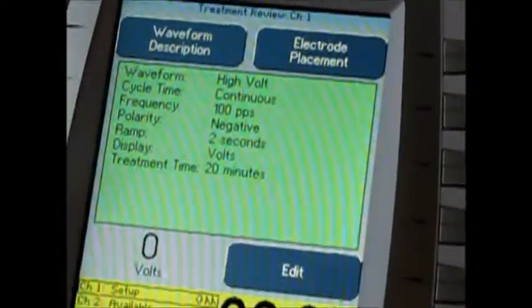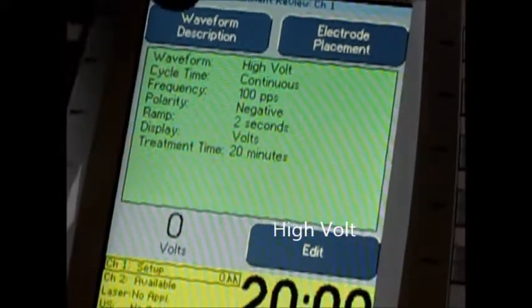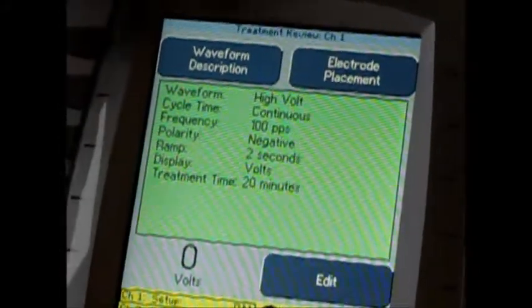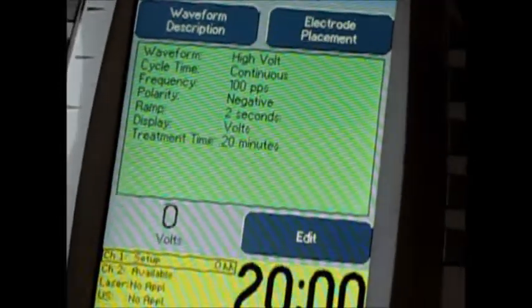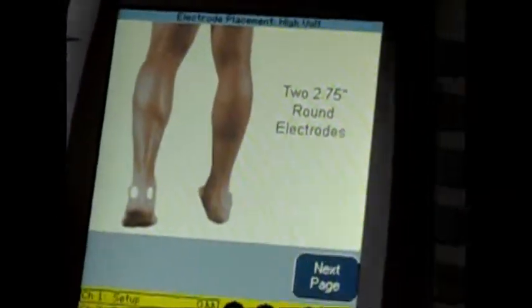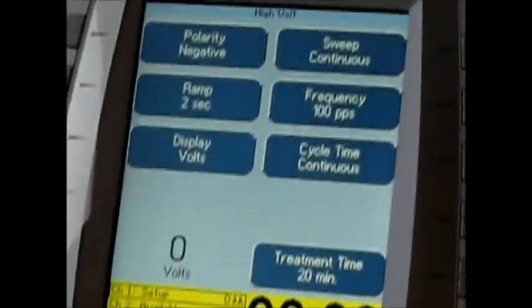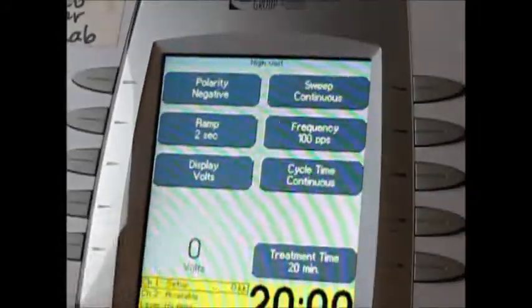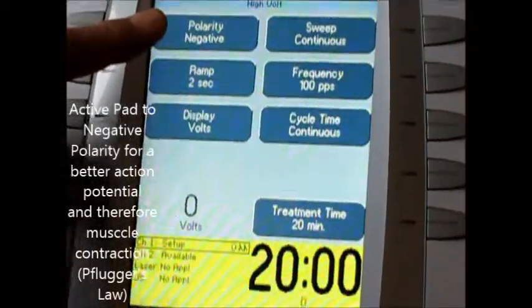The HiVolt machine comes with a readout screen right here. The first button up here that you could push if you didn't know what the waveform HiVolt was is a description button. In my classes, I don't let them go near that button because they should know from class. Electrode placement shows some different ways to set the electrodes up. As with always on the Chattanooga, I try to get right away to the edit screen. The settings you're going to be using in HiVolt: the active pad needs to be set to the negative, or the cathode, because of Pflueger's Law.